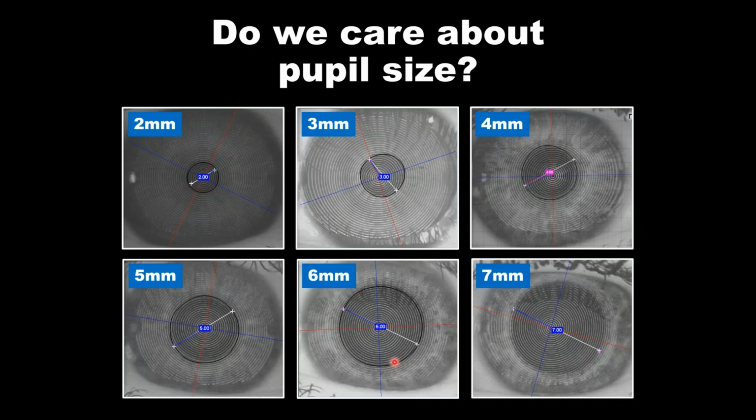Now, pupil size is another important value that I think we overlook, kind of like the visible iris diameter. When are we dealing with the incredibly small pupil? If we're trying to fit a multifocal contact lens that has its add power at 3 or 4 millimeters, how are we going to provide that patient with multifocality when their pupil may only be 2 mils?